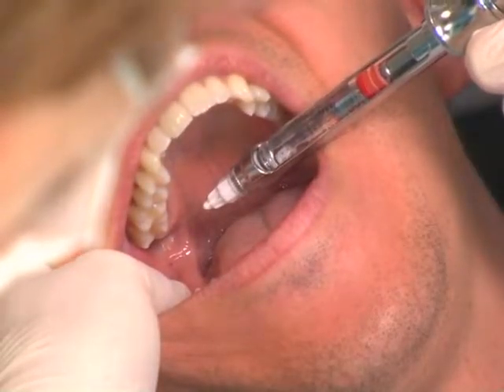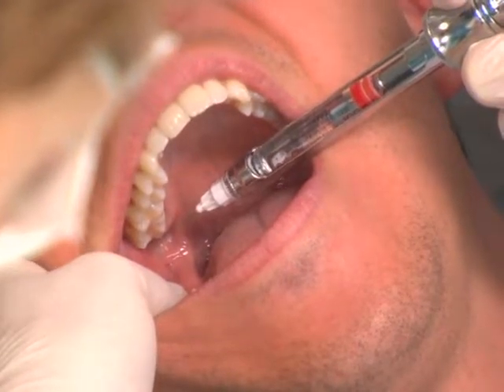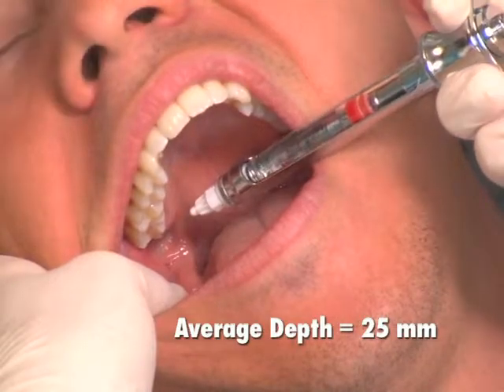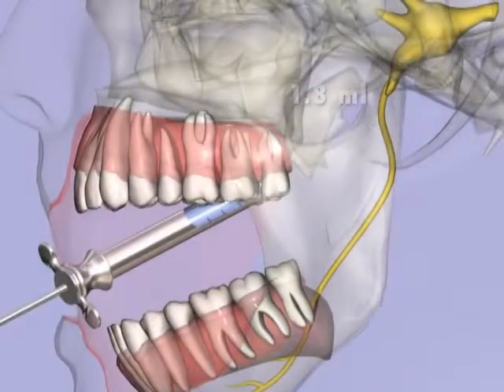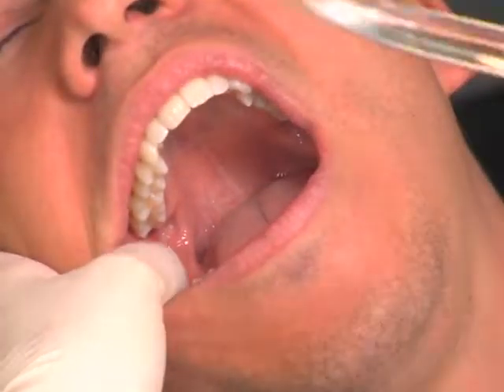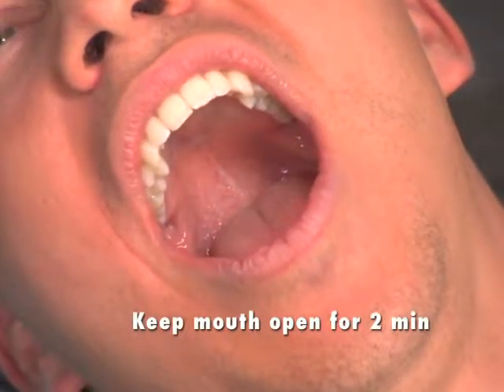The needle is now inserted until bone is contacted. The average depth of penetration in the Gow-Gates injection is approximately 25 millimeters. After negative aspiration, 1.8 mL of anesthetic is slowly administered. Following withdrawal of the syringe, the patient is asked to keep their mouth open for 2 minutes.